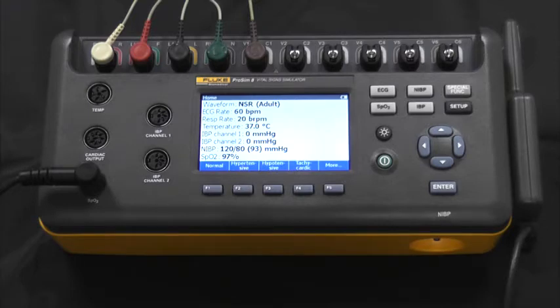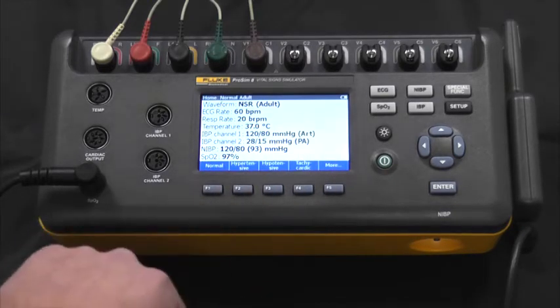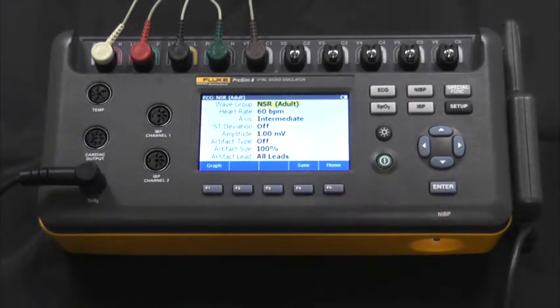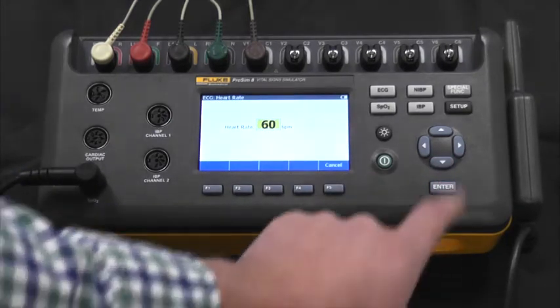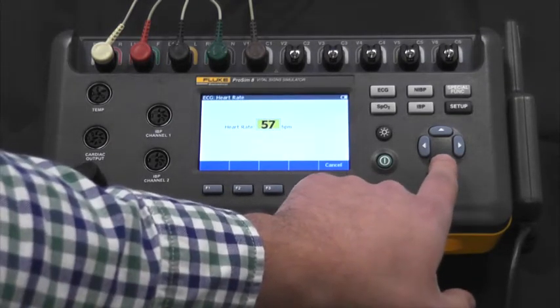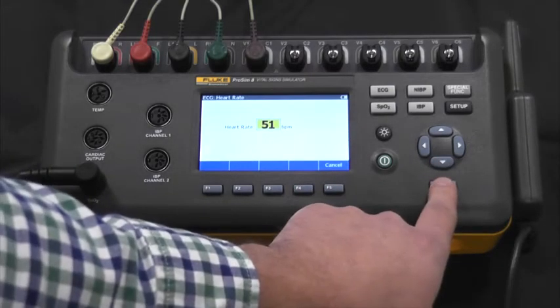You can also go through the functional buttons to adjust these. Right now we'll be in normal, we'll go to ECG, and we can adjust the heart rate to exactly what the patient monitor manufacturer states in their service manual.